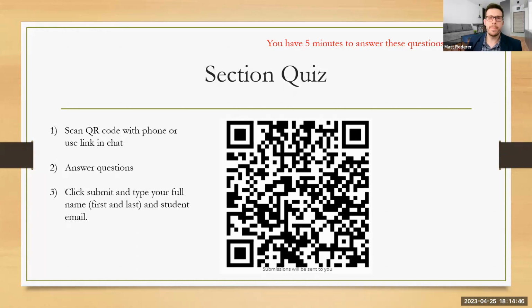CT can't see that subject contrast very well between cerebrospinal fluid and a disc. So it's very hard for them to rule that out. So that's why they need MRI. In MRI, there's no question. It's dark disc on bright cerebrospinal fluid. In CT, it's dark disc on dark cerebrospinal fluid. So it's dark and dark.